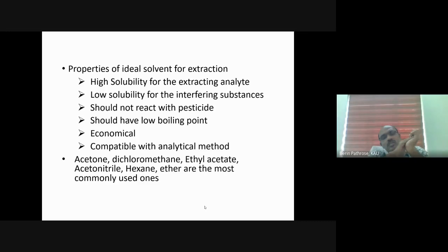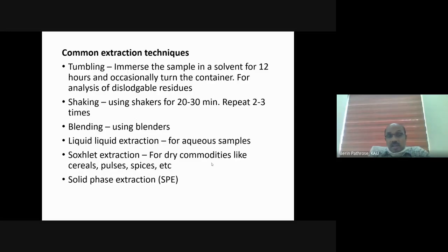The most common solvent employed in pesticide residue analysis nowadays is acetonitrile. Hexane, acetone, dichloromethane, ethyl acetate, ether, etc. are also used, but now the most common one is acetonitrile.